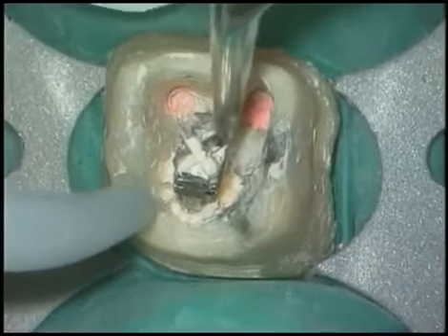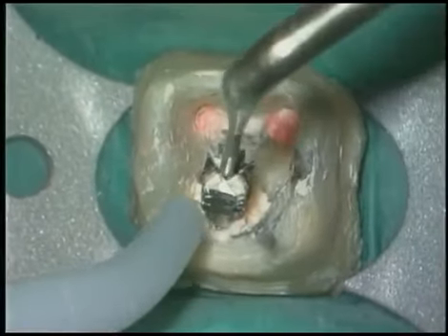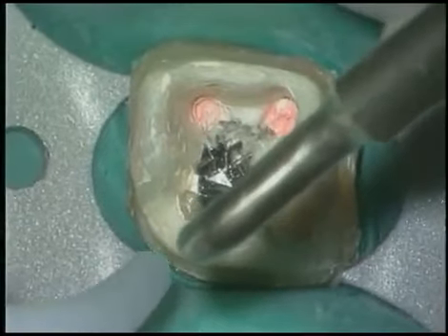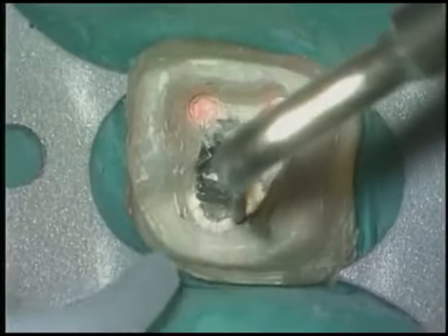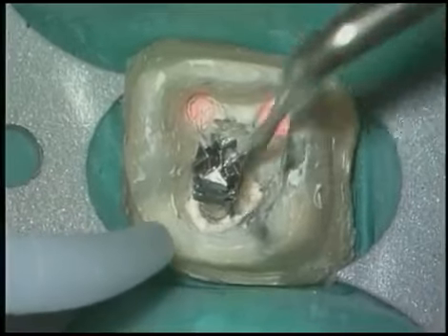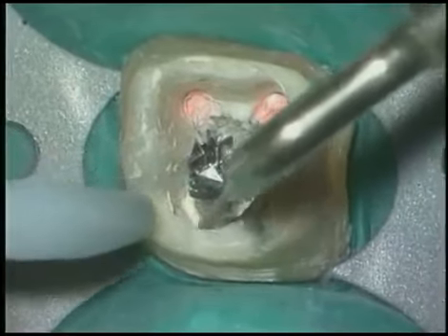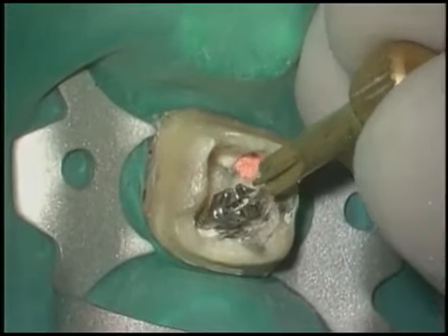The post is progressively freed up, and as we work into tight areas, like between axial walls, or like in this case, the head of the post, we'll go to a Pro Ultra Endo 4. This is used at the lowest power setting that will efficiently accomplish the clinical task. Its small profile can work easily between the post and an axial wall, and in tight spaces where the larger Endo 2 would have trouble. We can even remove cements at the orifice level or slightly below, which will encourage subsequent removal procedures. These instruments are used very, very lightly, and it's surprising how much cement can be blown out.